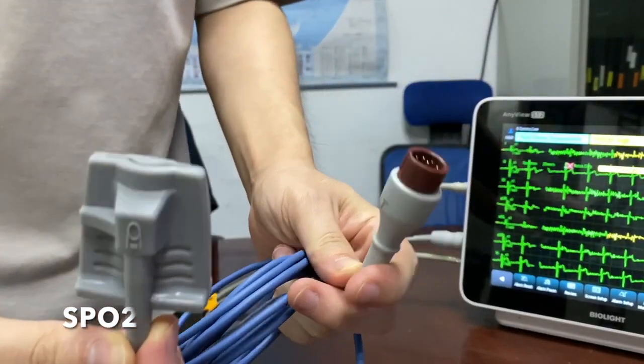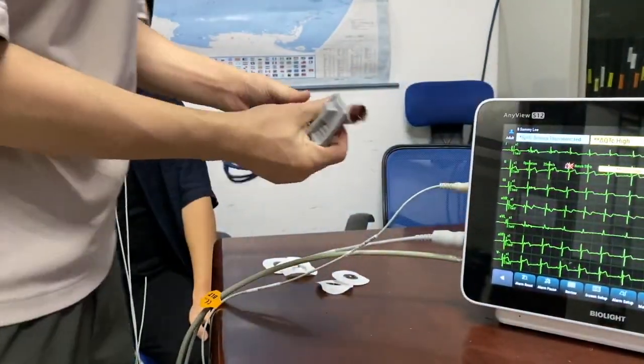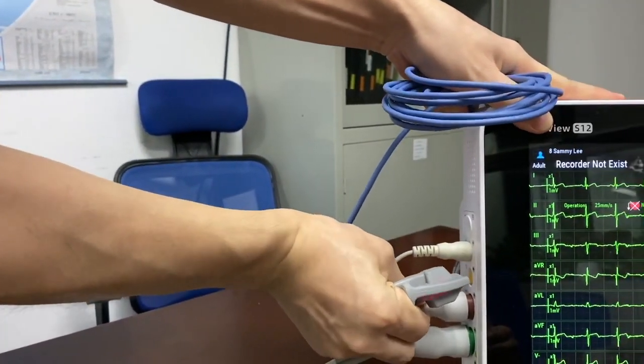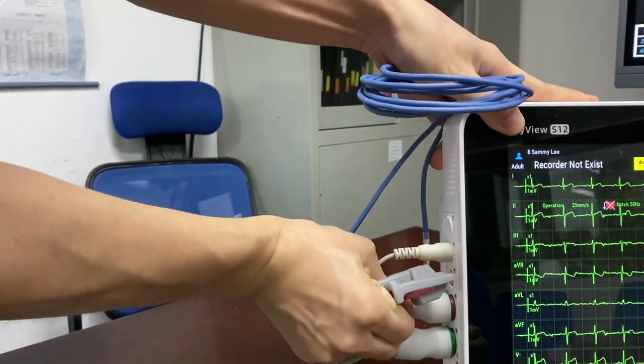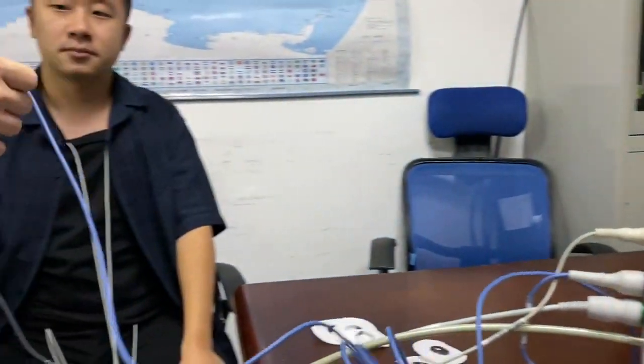This is the SpO2 probe, which is 9 pin, and I'll be connecting it to the S12. Once I plug it in, I'm able to put it onto the patient's hand.